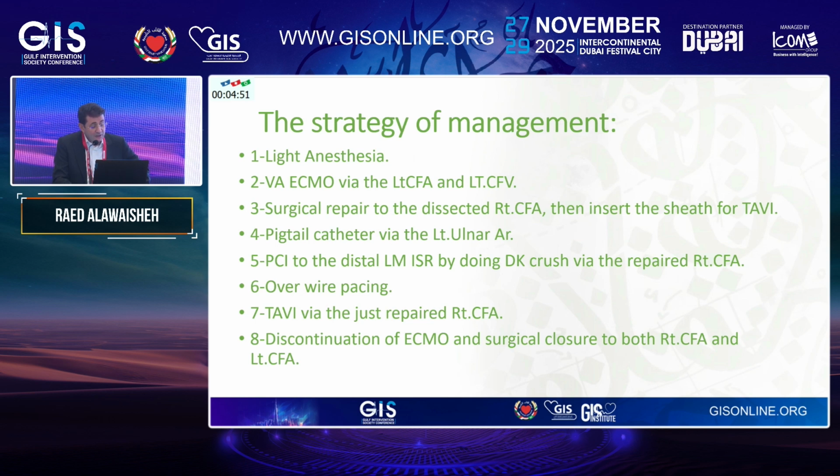Then PCI to the left main in-stent restenosis using a DK crush technique through the right common femoral artery, the one just repaired with the sheath inserted. Then overwire pacing, and TAVI through that sheath, and then discontinue ECMO inside the OR.